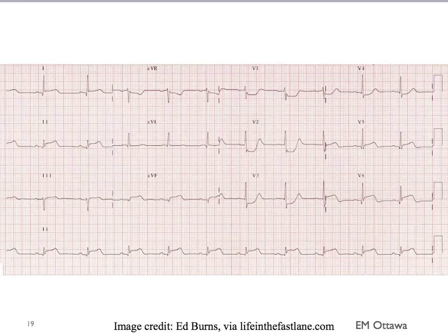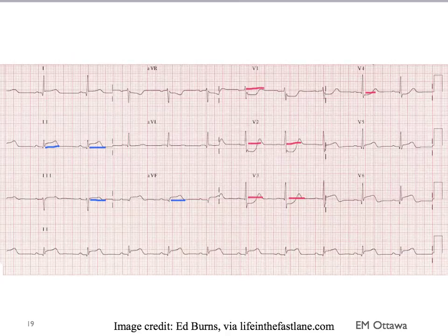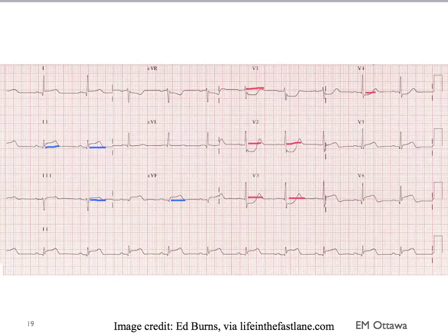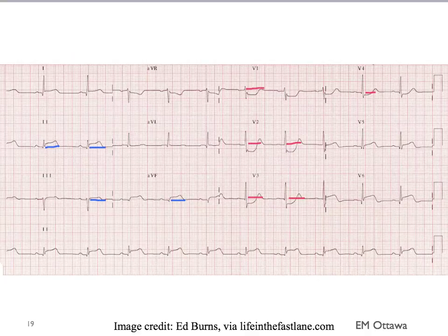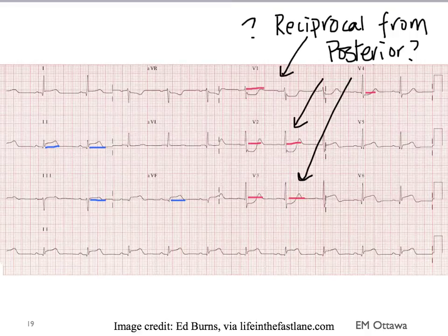How about this one? There are very subtle ST elevations in the inferior leads. There are also ST depressions in V1 to V4 in the anterior leads. We know the inferior wall reciprocates with the lateral, not the anterior, so the anterior ST depressions must be coming from something else — possibly ischemic changes, or reciprocal changes from a posterior ST elevation MI. This is one of the reasons we perform a 15-lead ECG, looking for posterior leads.